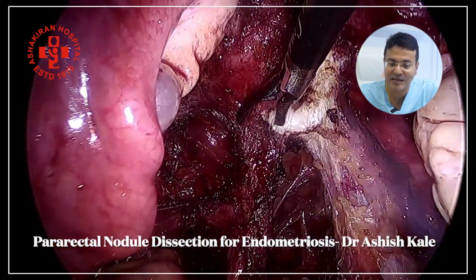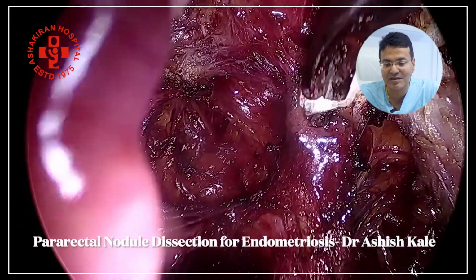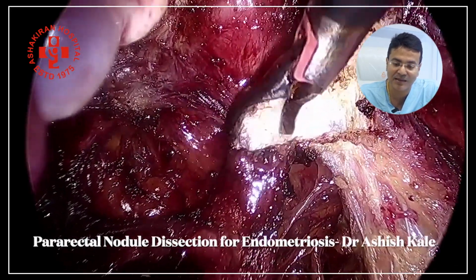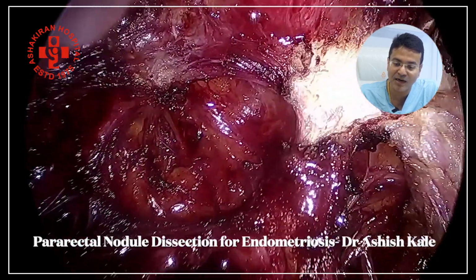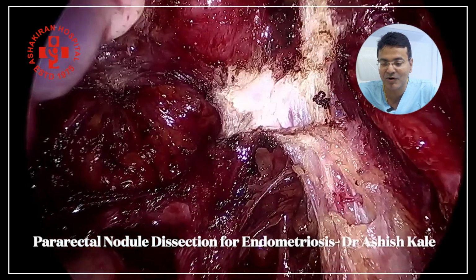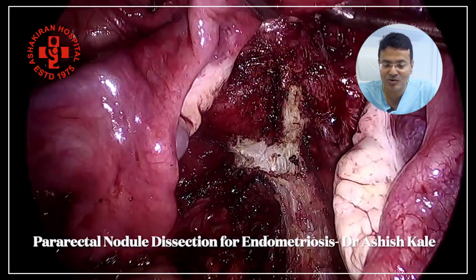Once this dissection is done, this is the dissection on the other side of the uterosacral ligaments. Already the pararectal nodule on the left side is dissected out. You can see the pararectal dissection is already carried out, and this is the uterosacral ligament where we are dissecting. Once the uterosacral ligaments are taken care of, what remains is just to have the pouch of Douglas freed from both sides. Here you can observe, if we are in a proper plane, the dissection goes very well.